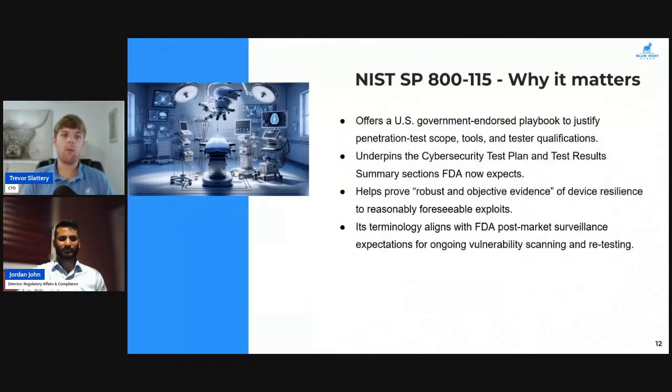Now, where this can get a little bit risky is since we've talked about the test planning, the test case requirements that are enforced by the FDA, these are fairly unique as far as certain different industries, which a lot of manufacturers may be familiar with. We can talk about HITRUST, HIPAA, PCI compliance, which don't have the exact same reporting or documentation requirements.